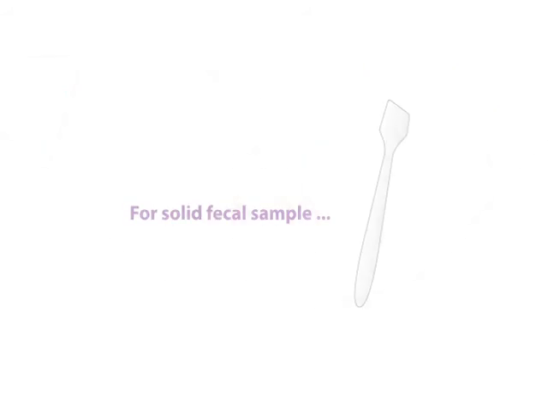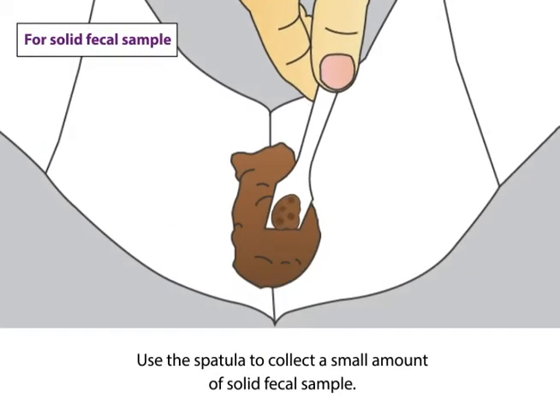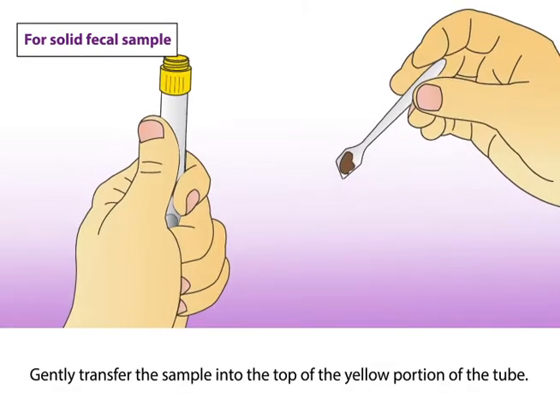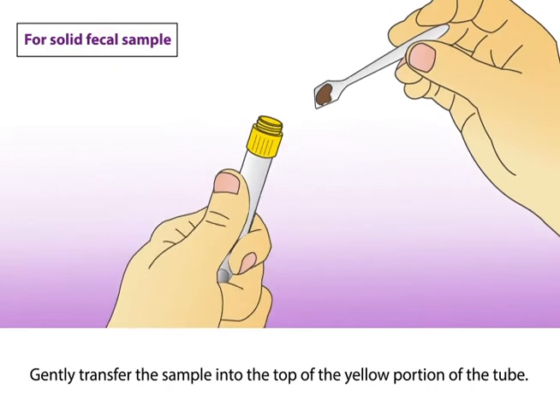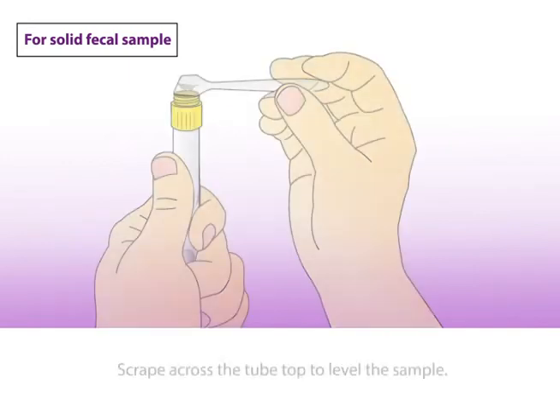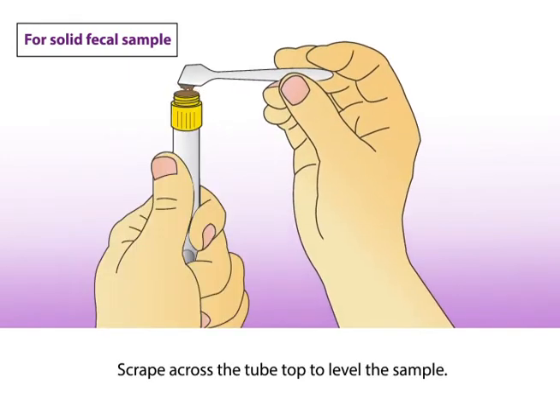For solid fecal sample, use the spatula to collect a small amount of solid fecal sample. Gently transfer the sample into the top of the yellow portion of the tube. Do not push the sample into the tube. Scrape across the tube top to level the sample.